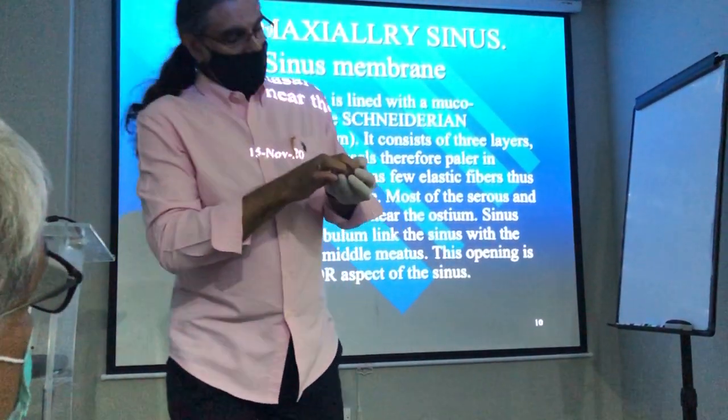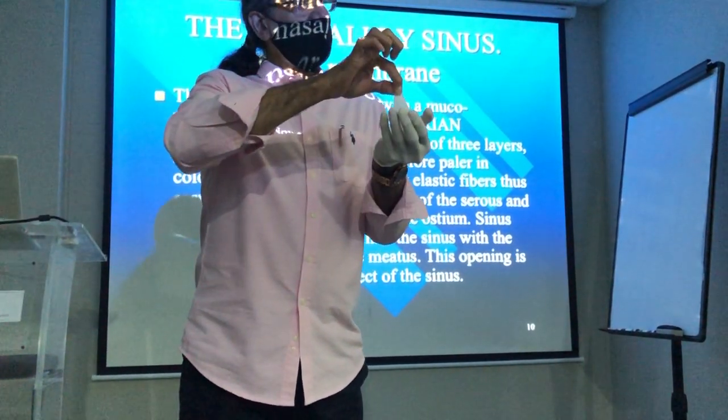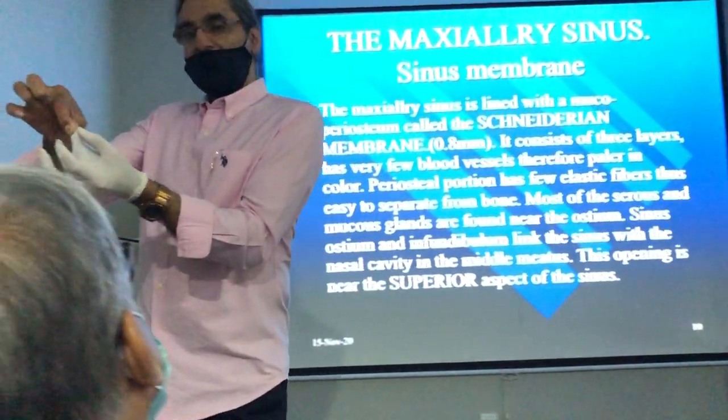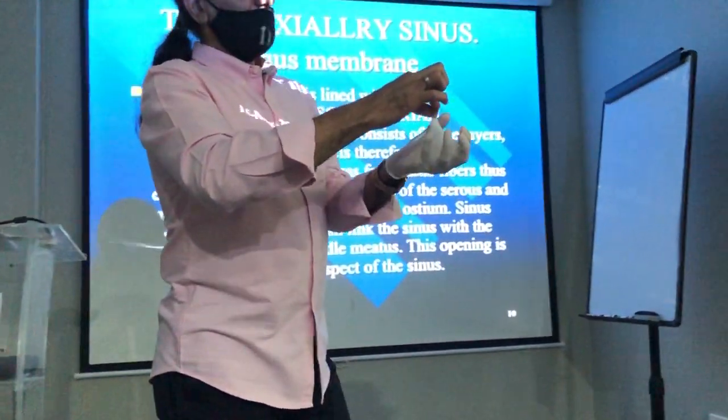And the whole purpose is that we actually lift this up like a tent, considering that the implant is coming from below here, and pack the bone inside so that we get enough height of the bone to place an implant.